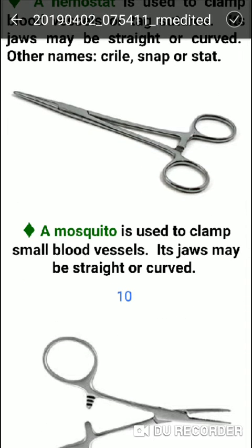The mosquito hemostat is used to clamp small blood vessels. It is designed for small clamping with fine jaws.